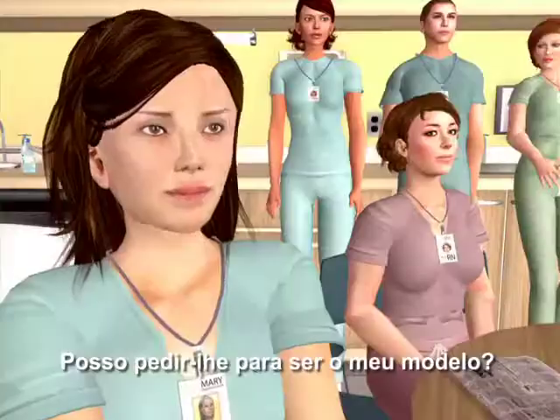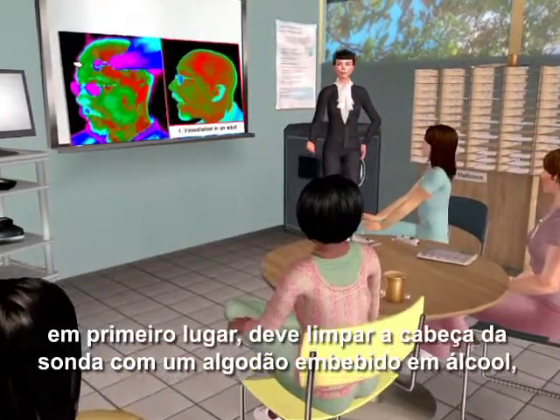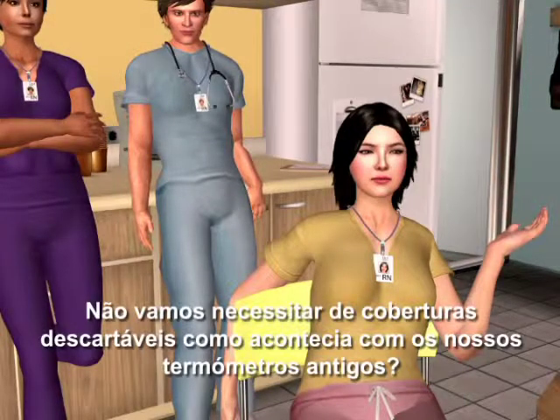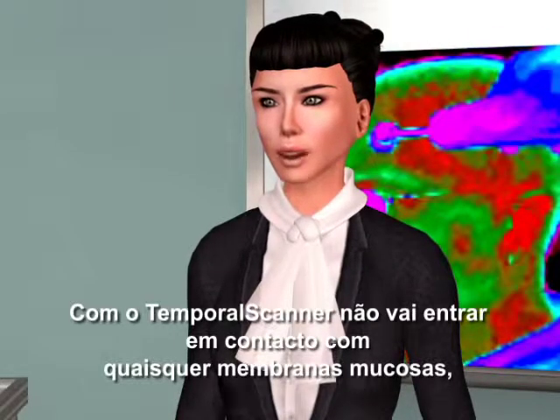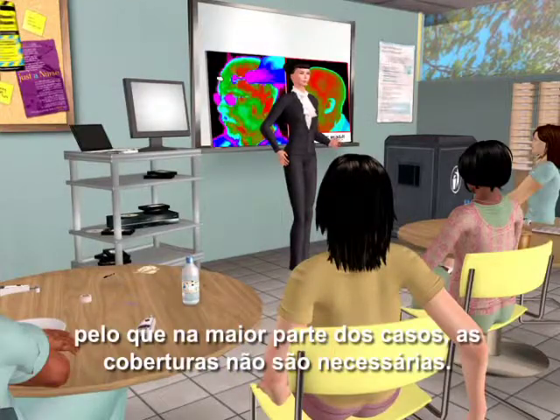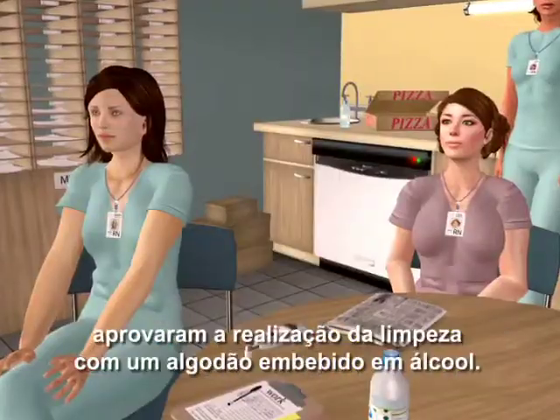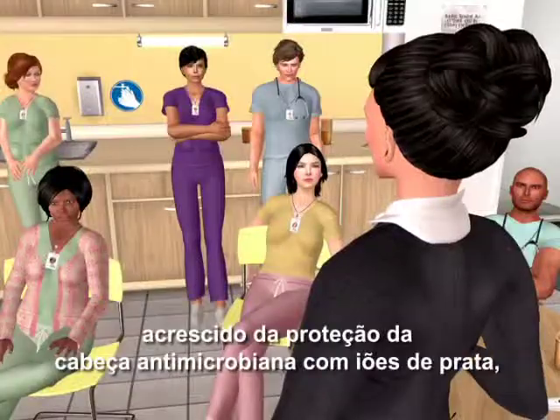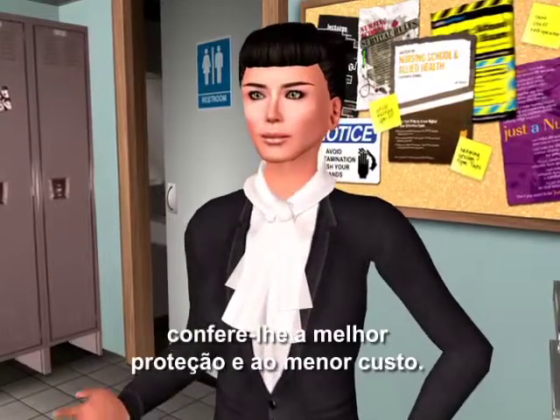Depending on the patient, you would first wipe the probe head with an alcohol prep pad, as you would with your stethoscope. With the temporal scanner, you are not contacting any mucous membranes, so in most cases, covers are not required. More than 90% of the hospitals using Exergen Temporal Scanner Thermometers have approved wiping with an alcohol prep pad. The alcohol swab, plus the protection of the silver ion antimicrobial head, give you the most protection and the least cost.